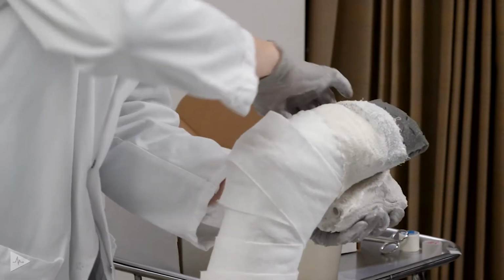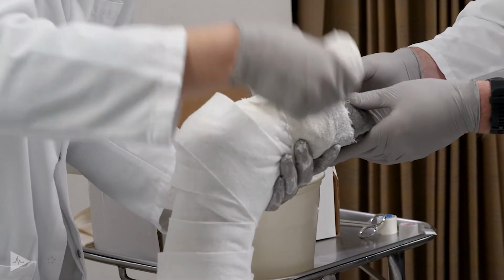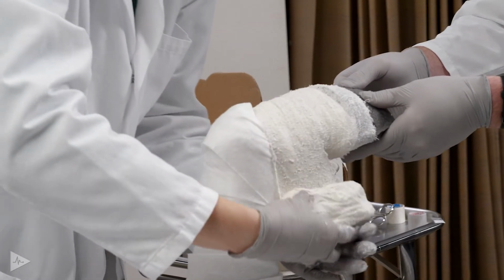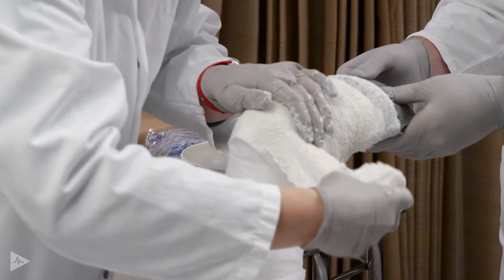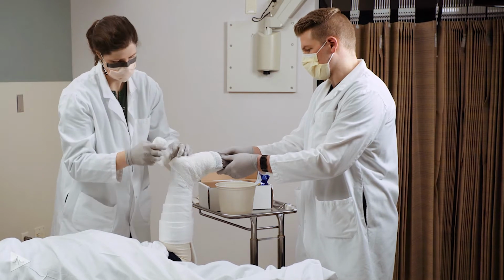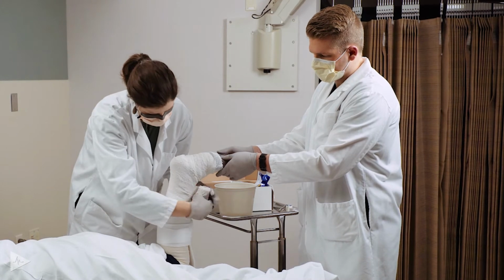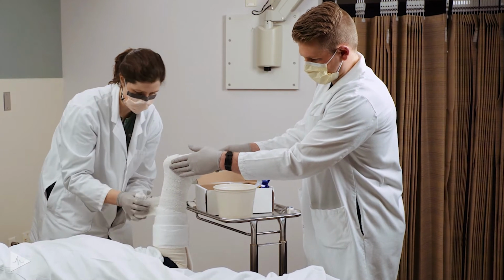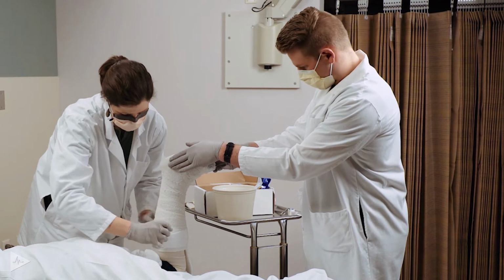And we will start wrapping circumferentially. So if you want to hold her toe down, thank you. Help keep that foot at a 90-degree angle. You want about a 50% overlap on the plaster. The ankle can be the hardest section to go through because of the angle with keeping the foot at a 90-degree angle. You want to continue to overlap as we're coming down the leg.